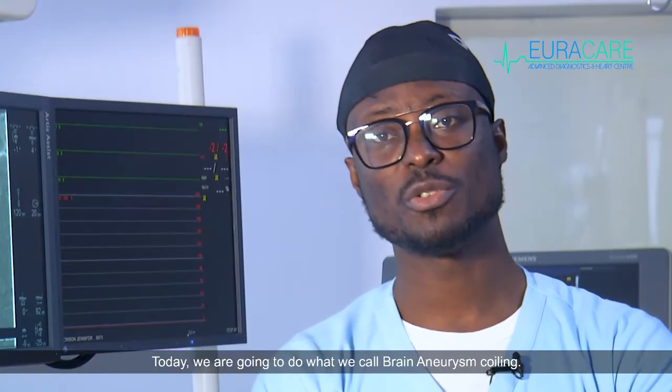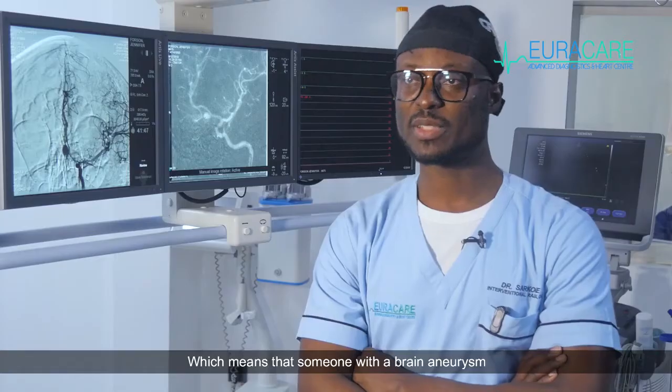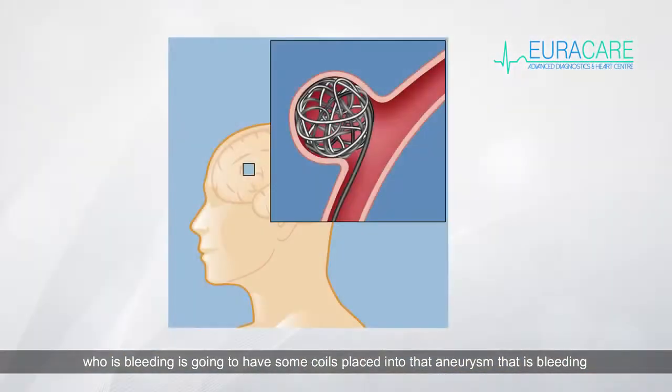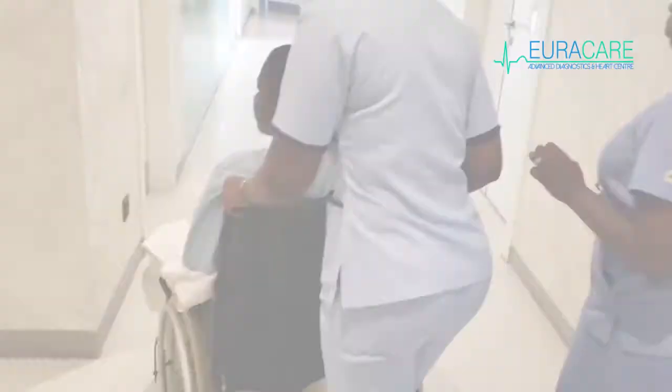Today we are going to do what we call brain aneurysm coiling, which means that someone with a brain aneurysm who is bleeding is going to have some coils placed into that aneurysm that is bleeding to save this person's life.